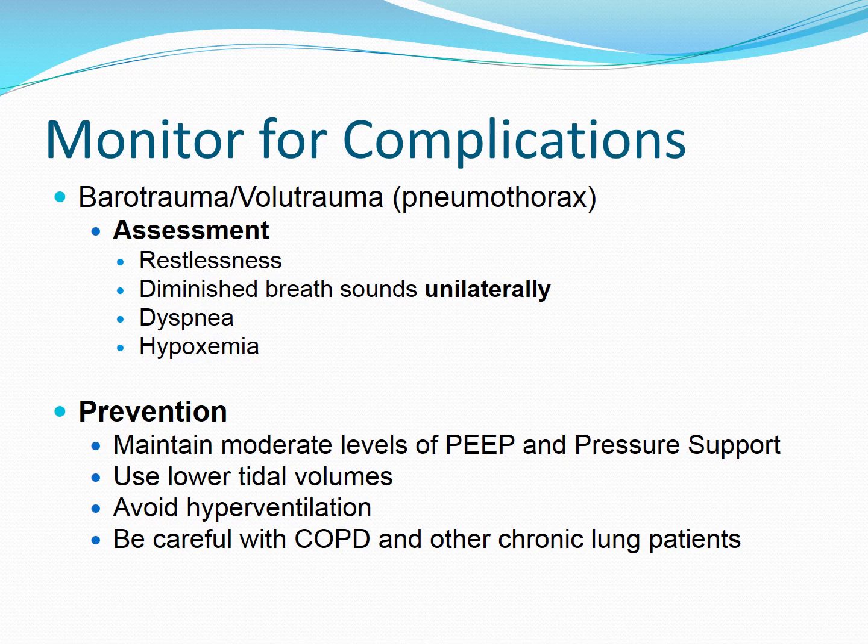So you need to really listen to those breath sounds. And on the side where that pneumothorax is, those breath sounds are going to be very diminished, or you're not going to hear them. The other thing that you'll notice is that when you look at blood gases, the patient's oxygenation status is dropping. So we also need to look at that. So how do we prevent this? Well, the goal is to try not to use high levels of PEEP.